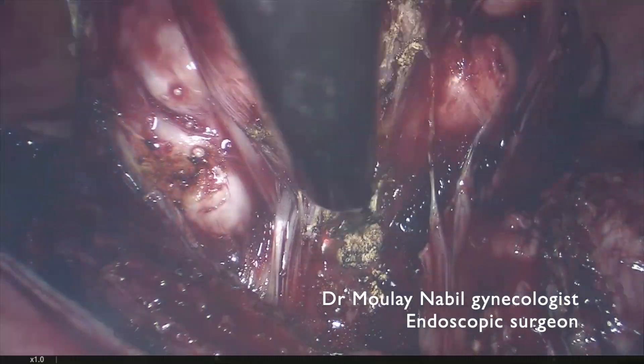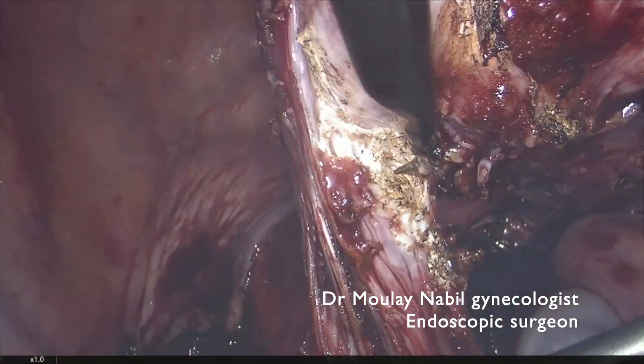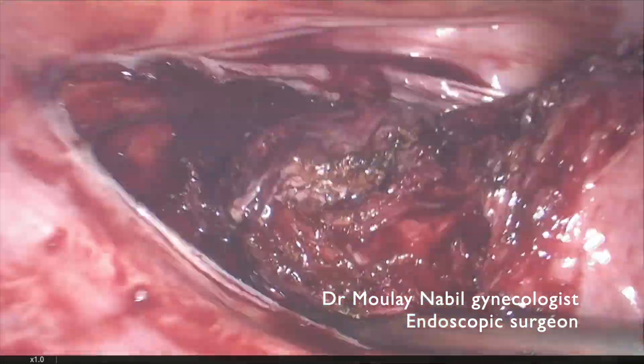The myomectomy is quite bloodless. In Morocco we do not have the right to use vasopressin as in India, so the myomectomy is done without it.